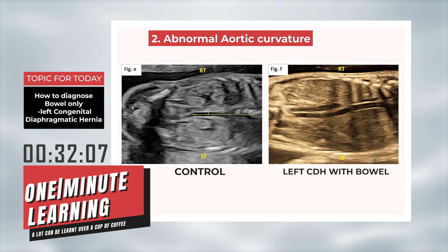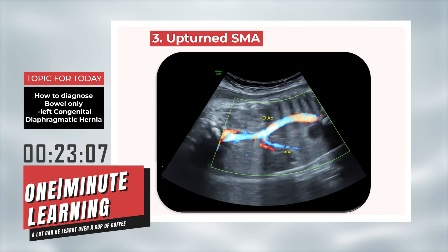The second clue is: if you manage to look at the thoracic descending aorta in a coronal section of the chest, you would find an abnormal curvature to the right side.